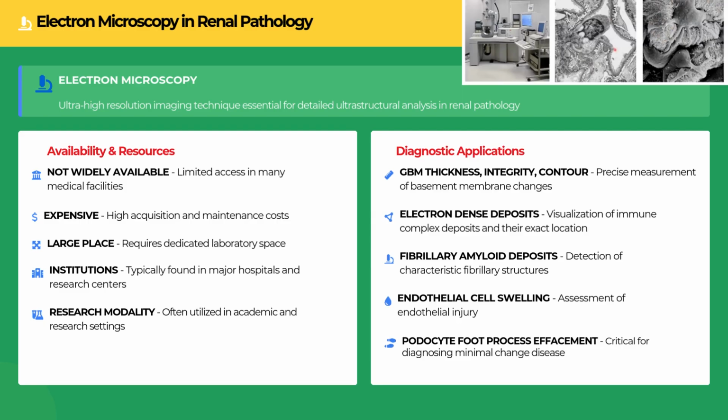It's typically available only in large institutes and large hospitals. Transmission EM allows visualization of ultrastructural changes, including electron-dense deposits, glomerular basement membrane thickness and any alteration in it, amyloid fibril thickness, podocyte effacement, and endothelial cell swelling.